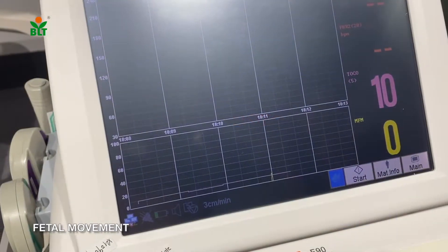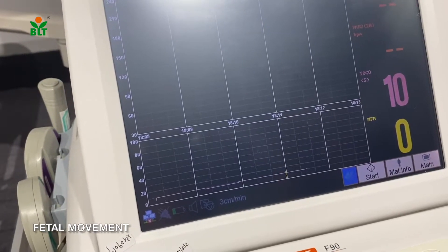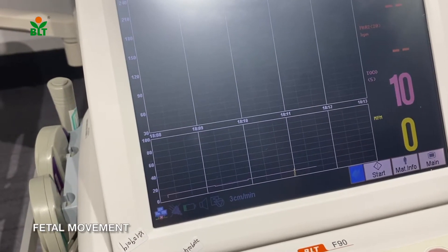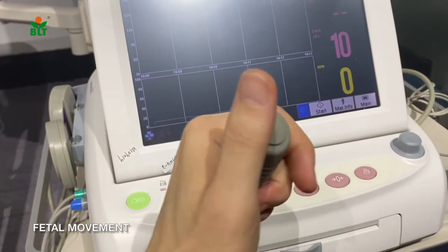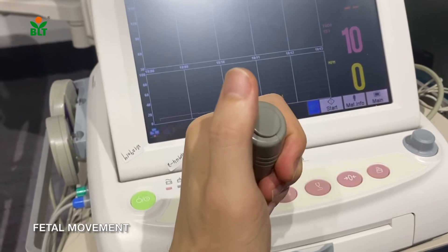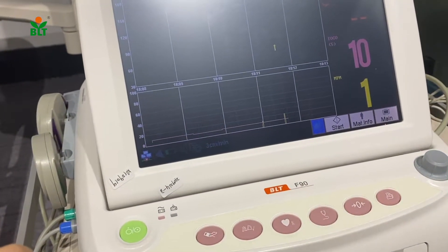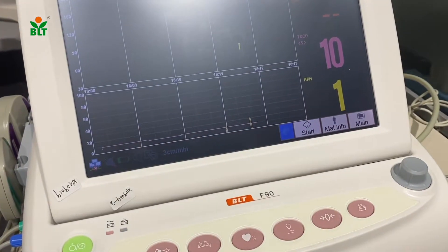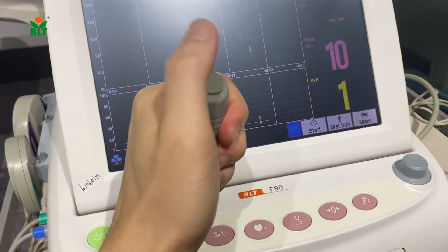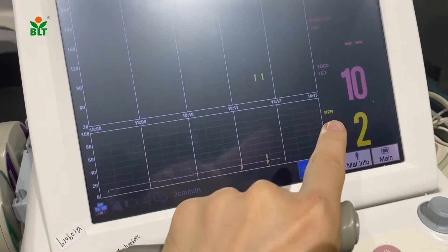We need to record fetal movement manually. We need to let the examiner hold the fetal movement button connected to the instrument. Once the examiner presses once, the fetal monitor will detect one fetal movement. Each press is recorded, and on the screen you will be able to see the fetal movement.